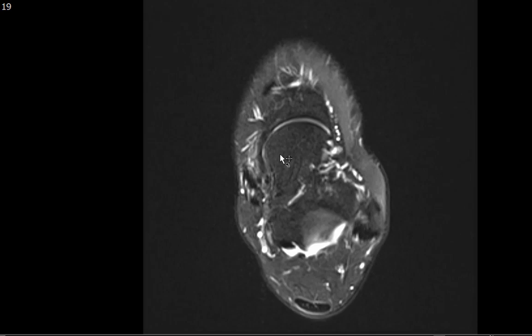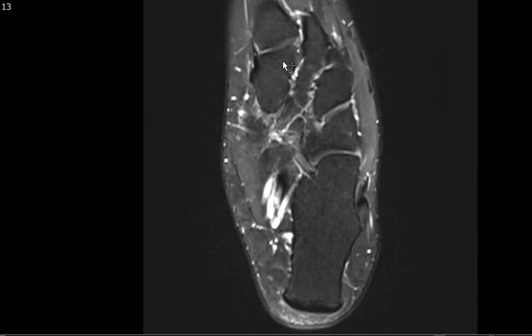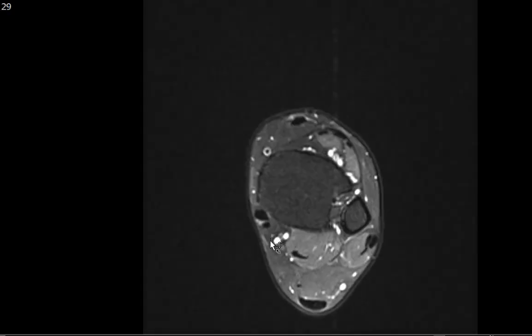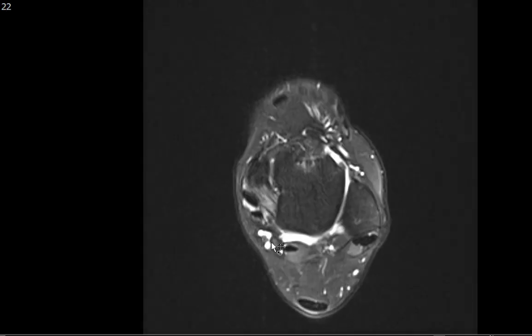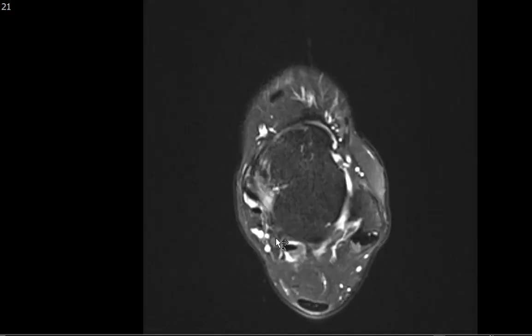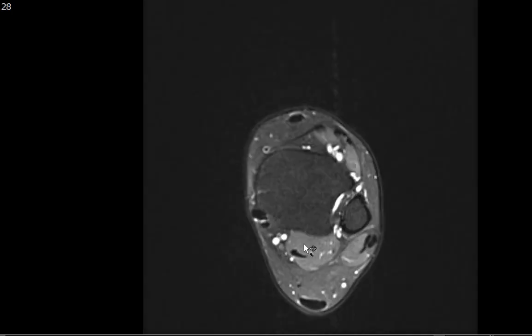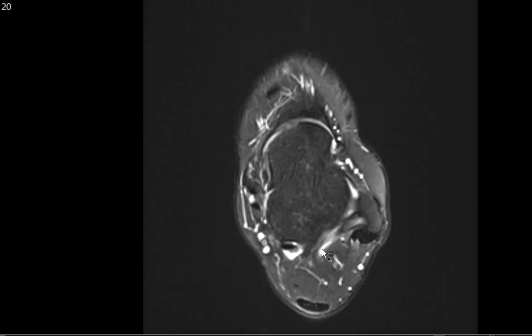The rest of the marrow signal intensity, aside from the edema within the os navicularis and median eminence of the navicular, looks pretty good. You can also see part of the Lisfranc ligament running between the medial cuneiform and the base of the second metatarsal — a hypointense band made up of dorsal, plantar, and interosseous components, important for midfoot stability. The tarsal tunnel, between the flexor digitorum longus and flexor hallucis longus tendons, carries the posterior tibial nerve, artery, and vein — always check for masses that could impinge on the posterior tibial nerve. The muscles show no T2 hyperintense edema to suggest contusion or strain.